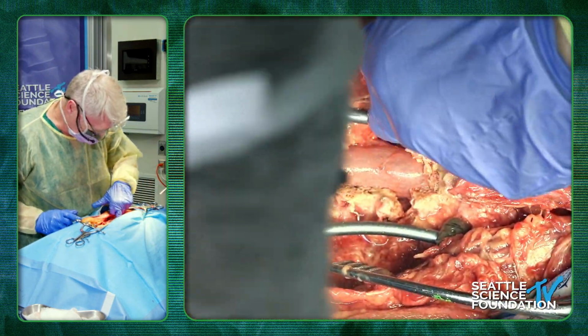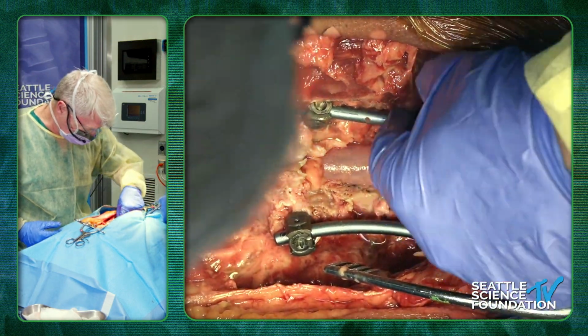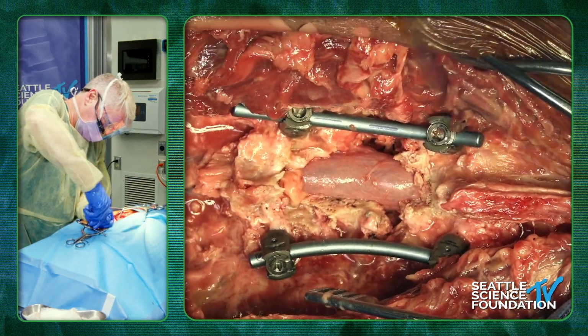But anyways, that's the gist of it there, guys. So that's my Smith-Petersen. And then we'll fill in the gap. So I actually take the bone here. So I would take, in this case, for a lumbar.